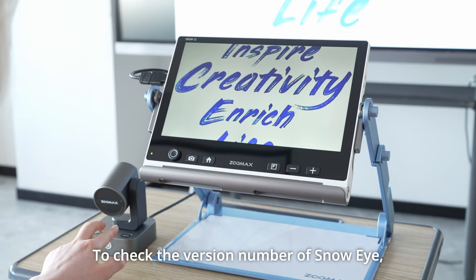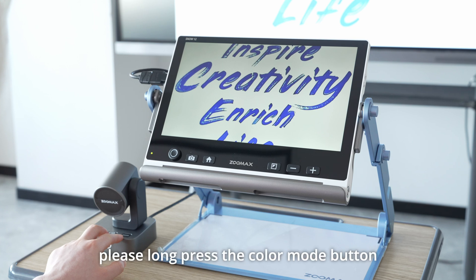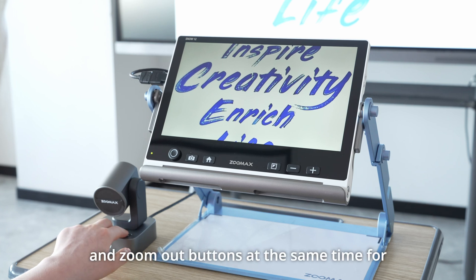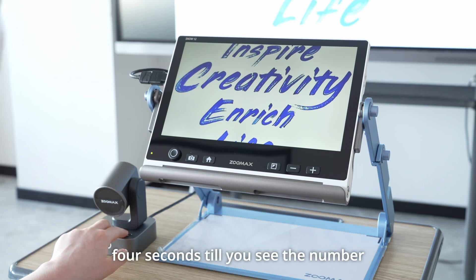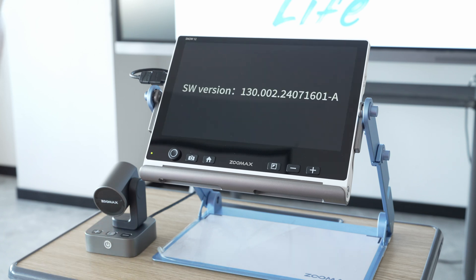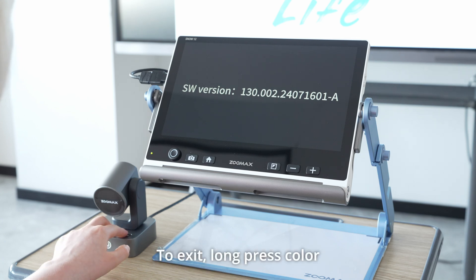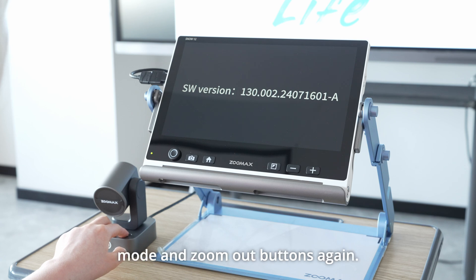To check the version number of Snow Eye, please long press the color mode button and zoom out buttons at the same time for 4 seconds till you see the number showing on the screen. To exit, long press color mode and zoom out buttons again.